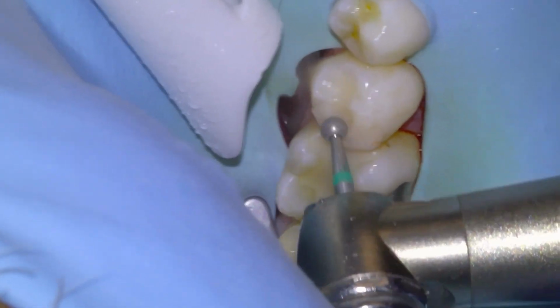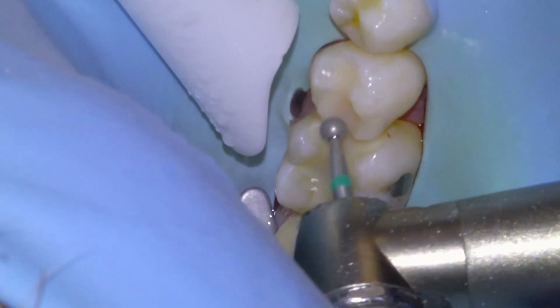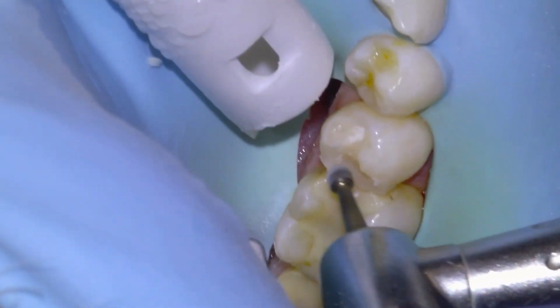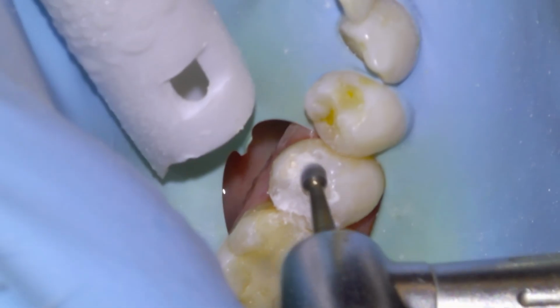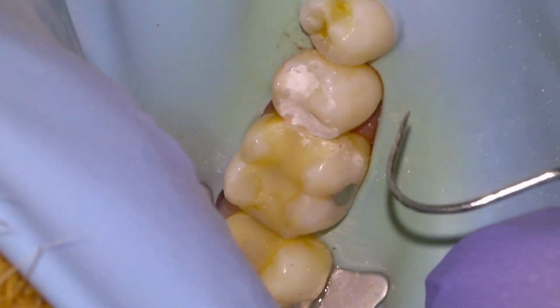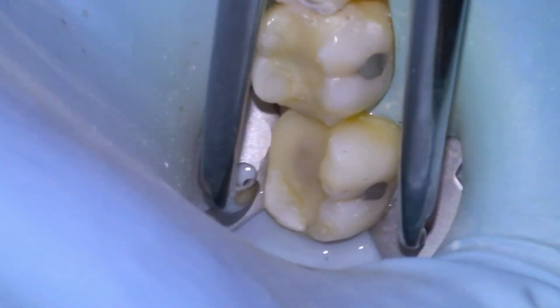We'll take a large round diamond and remove any excess restorative material. And once it's mostly back down to where we want it, we'll go over it with a carbide burr, slow speed carbide. And once we're happy with the finishing, then we'll take a little explorer and make a little groove for the floss to go in. Gonna take the rubber dam off and then start checking the bite.